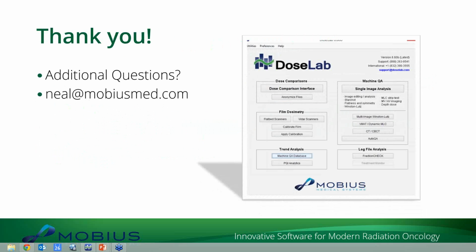Somebody asked what kind of MLC tests we can do. I think I went over that during the presentation, so hopefully you got the answers on that. Can we do anything for CyberKnife? Not that I can think of off the top of my head. Again, I can talk to Nathan and see if there's anything in here that would help with some of the CyberKnife checks, but I will double check on that for you afterwards and let you know.